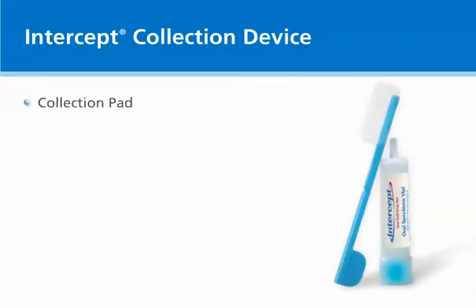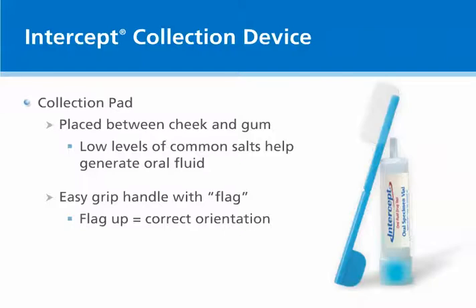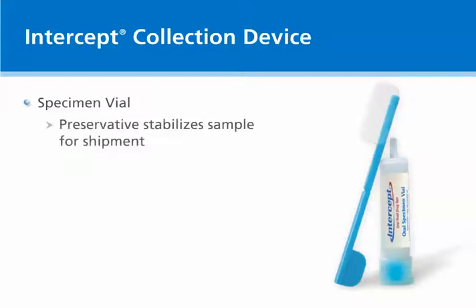The collection pad is designed to collect oral fluid from between the lower cheek and gum. The white pad contains low levels of common salt to help generate oral fluid and shorten the collection time. The device has an easy-to-grip handle with a flag to help ensure the proper orientation of the pad in the lower cheek. The specimen vial contains a blue liquid which is a preservative solution.